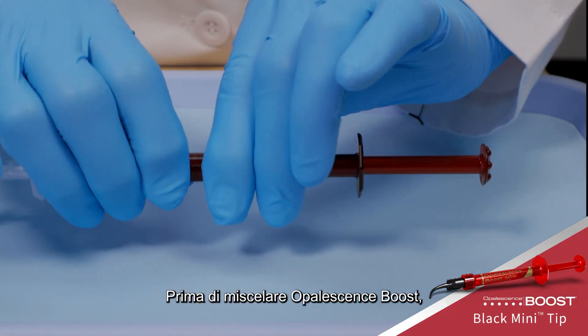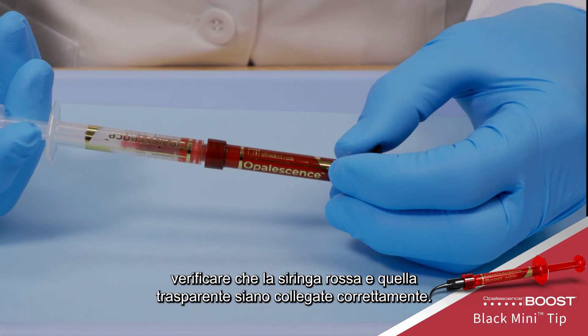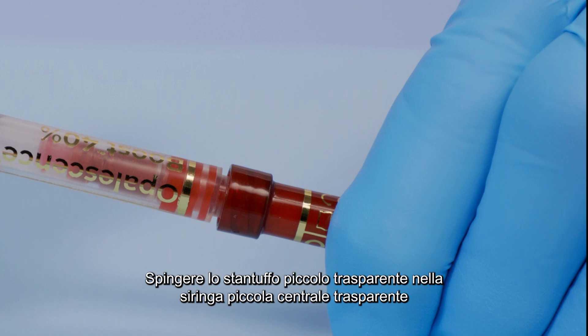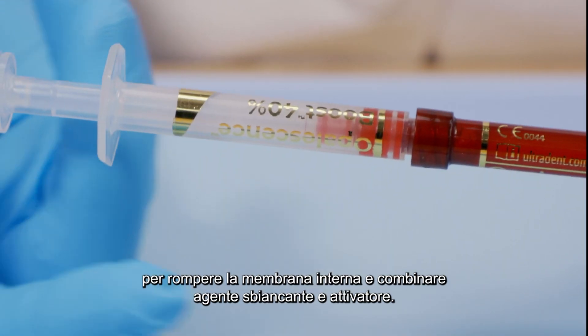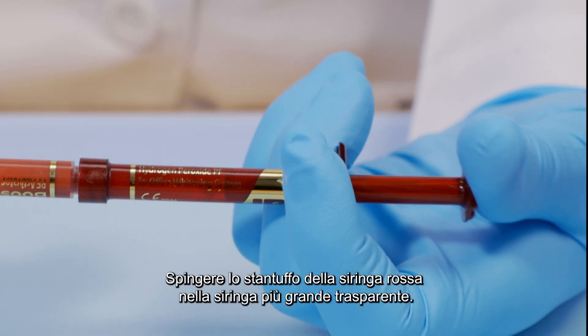Before mixing Opalescence Boost whitening, check that the red syringe is securely attached to the clear syringe. Depress the small clear plunger into the middle small clear syringe to rupture the internal membrane and combine the whitening gel and activator. Press the red plunger completely back into the clear syringe.